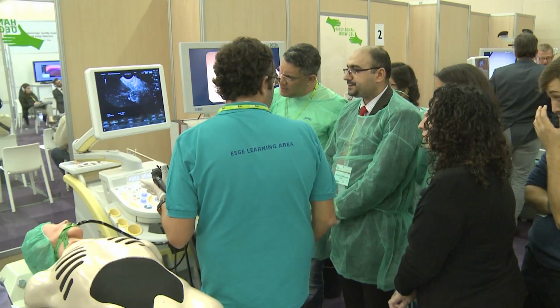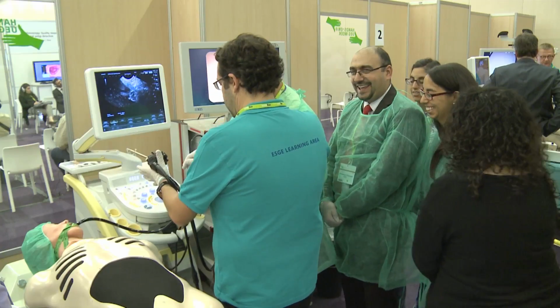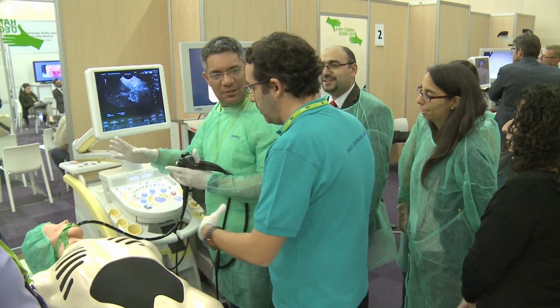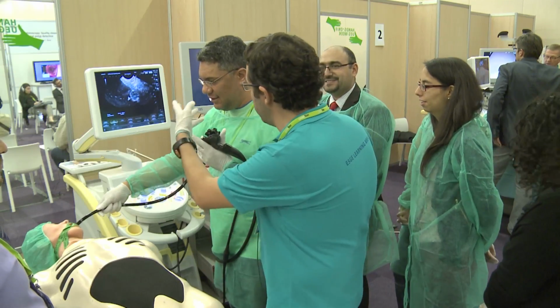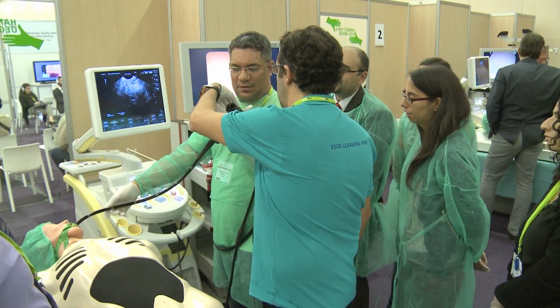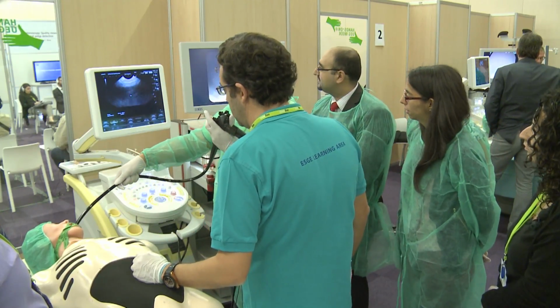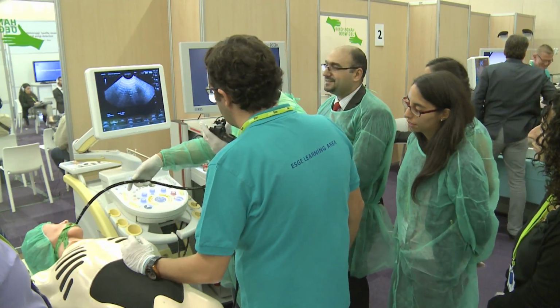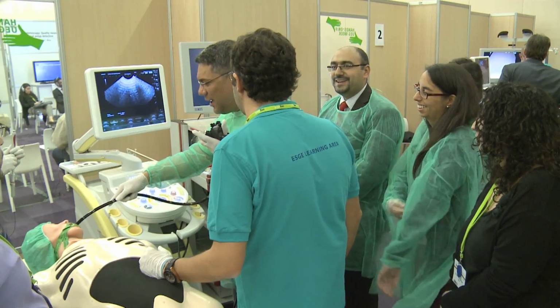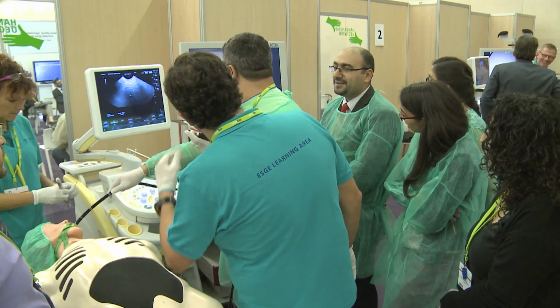So, whose turn is it? Come on. Go out and go again? Yeah, go ahead. We have everything there, so straighten the scope, just straighten the scope, and now go again, try to find the lesion. Don't put it out so much, so as not to break the esophagus of the model, so we can make it last longer. So you can go under endoscopic image.